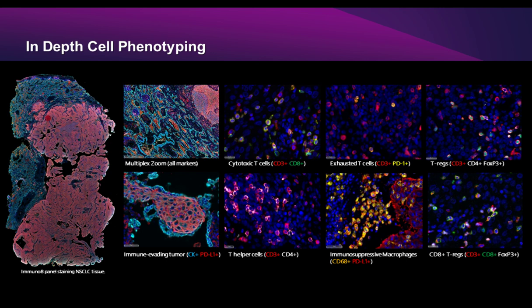But with fluorescence, the issue is not just optimizing the antibody concentration. You also have possibly the secondary concentration unless you directly conjugate it, but then you also have very low signal. So it's really a balance of signal and the affinity and avidity of the target that you're looking at. But then you also have to balance it against which channel works best relative to your antibody.